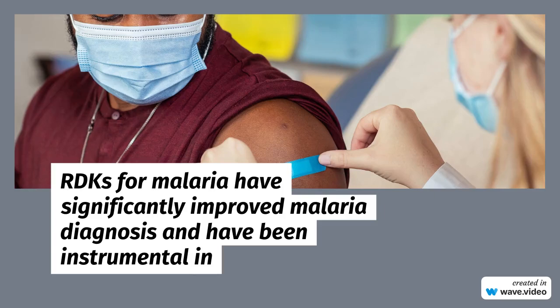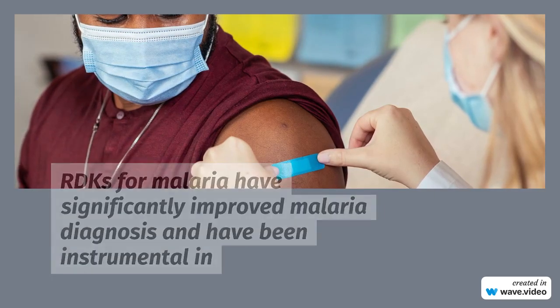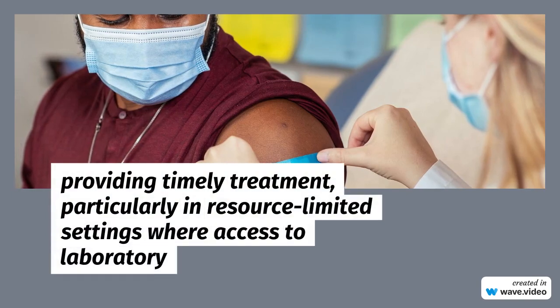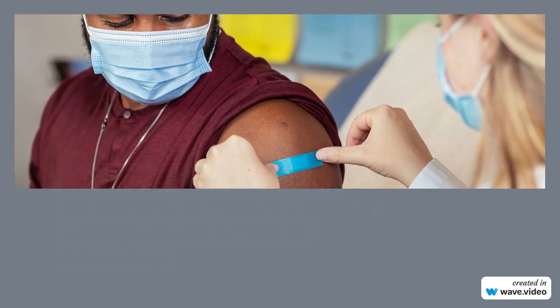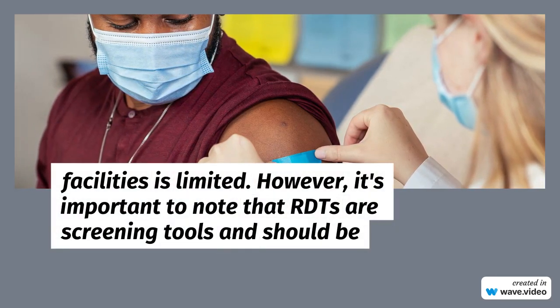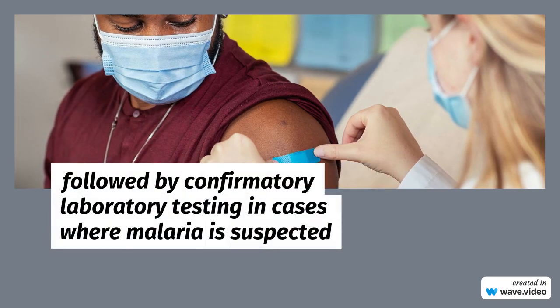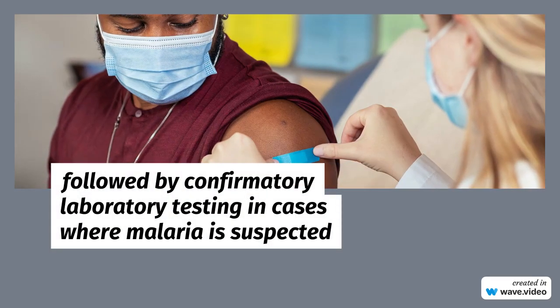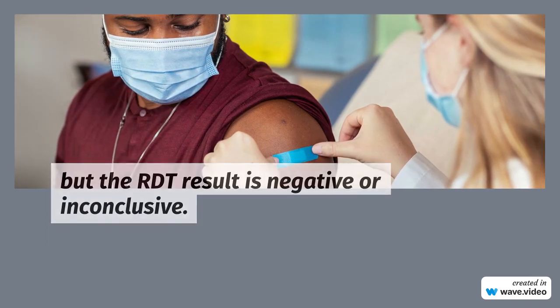RDKs for malaria have significantly improved malaria diagnosis and have been instrumental in providing timely treatment, particularly in resource-limited settings where access to laboratory facilities is limited. However, it's important to note that RDTs are screening tools and should be followed by confirmatory laboratory testing in cases where malaria is suspected, but the RDT result is negative or inconclusive.